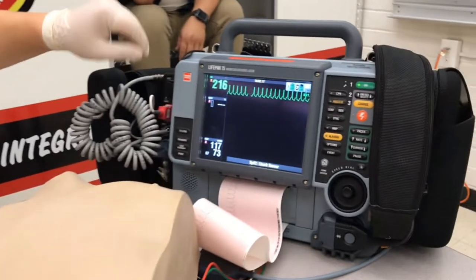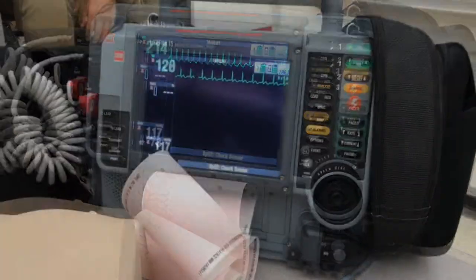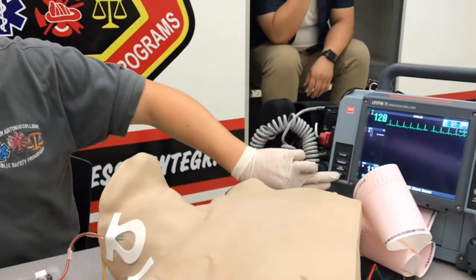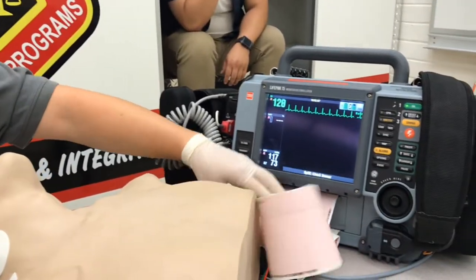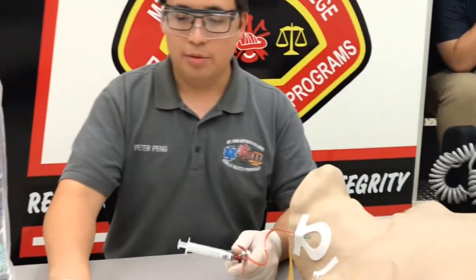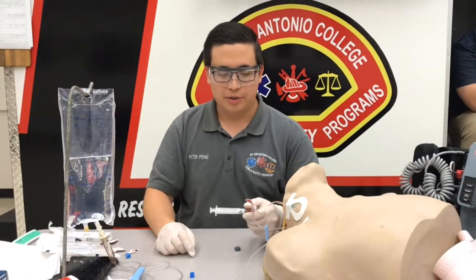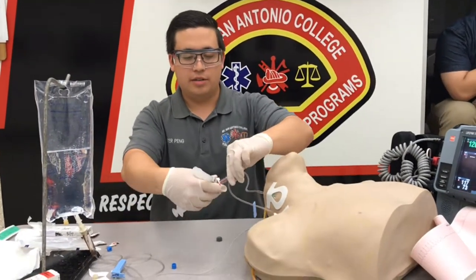Going back over to our patient and the monitor, we're hopefully going to see some kind of a conversion — looks like we have a conversion to sinus tach, so we can stop printing. Going back here, open up your line, make sure it's flushing well, and we can disconnect our stopcock.